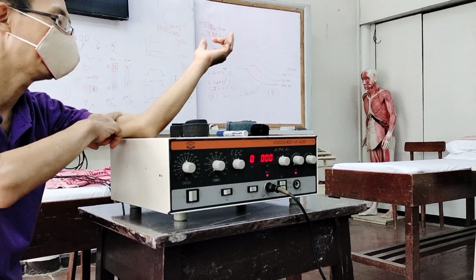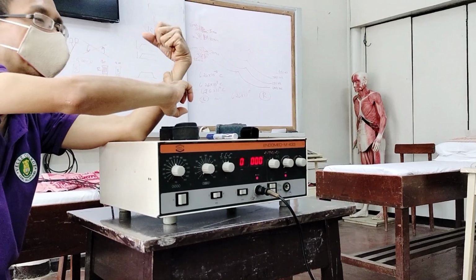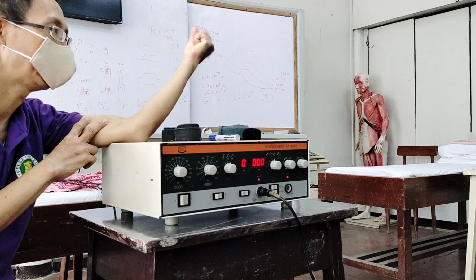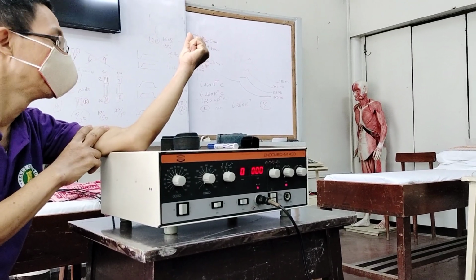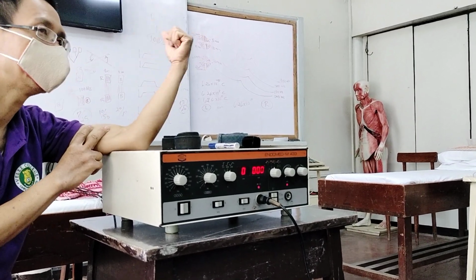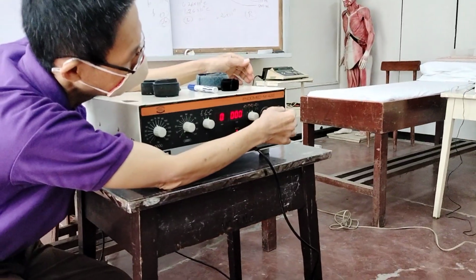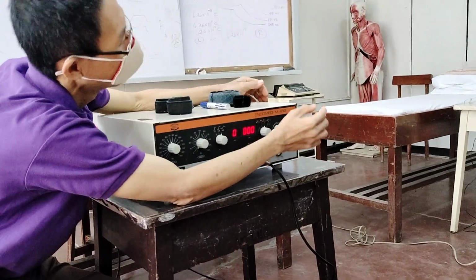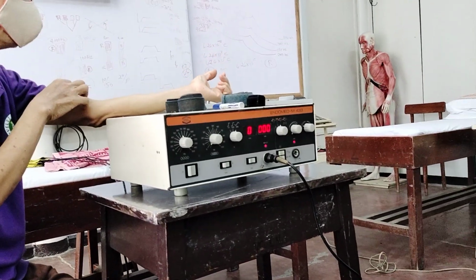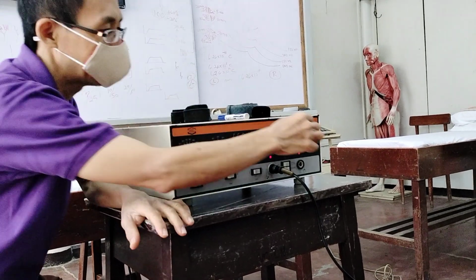So for example, this is red and this is black. Let's say the wrist flexors are very strong, and the elbow flexors, which are on red, are weaker. So you have to further increase the intensity on the red. Therefore, you transfer your current more towards the red so that it makes contact and you get more function.